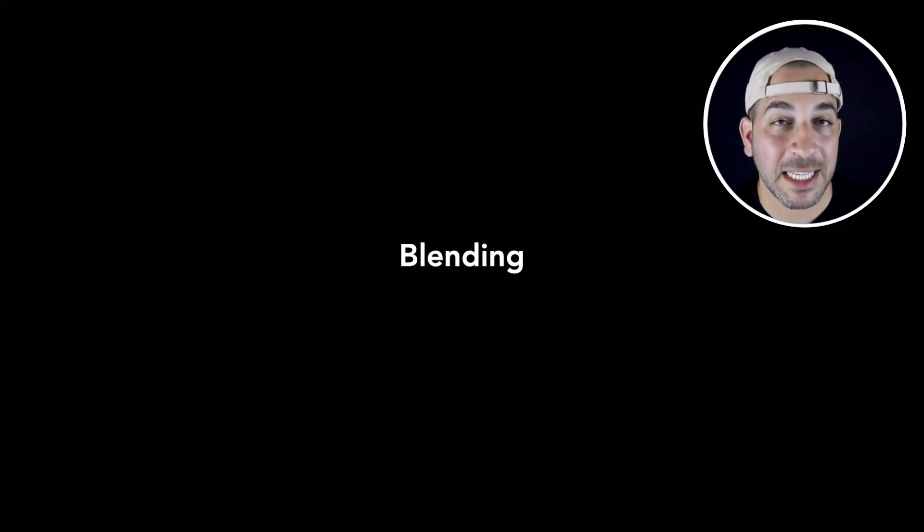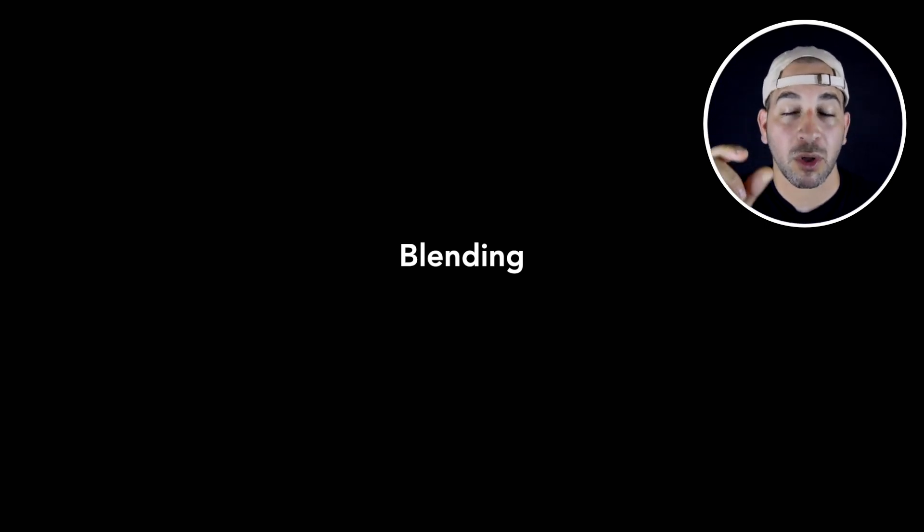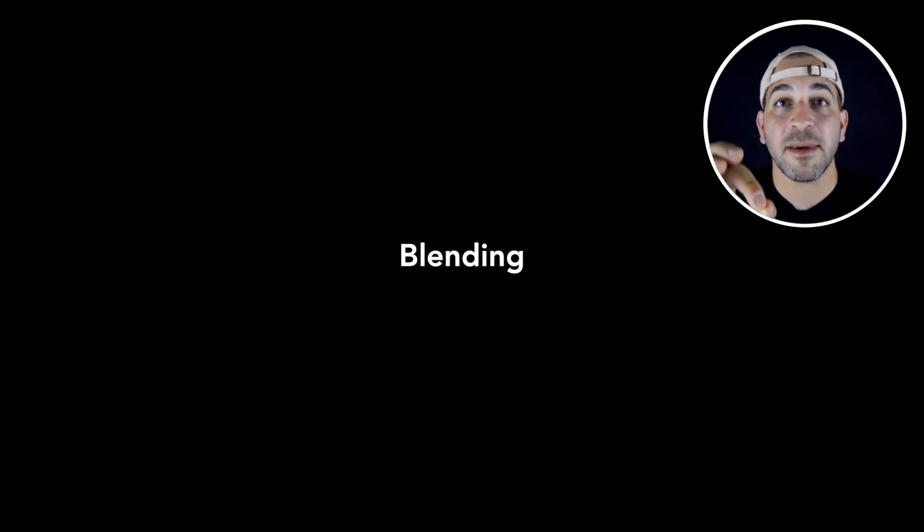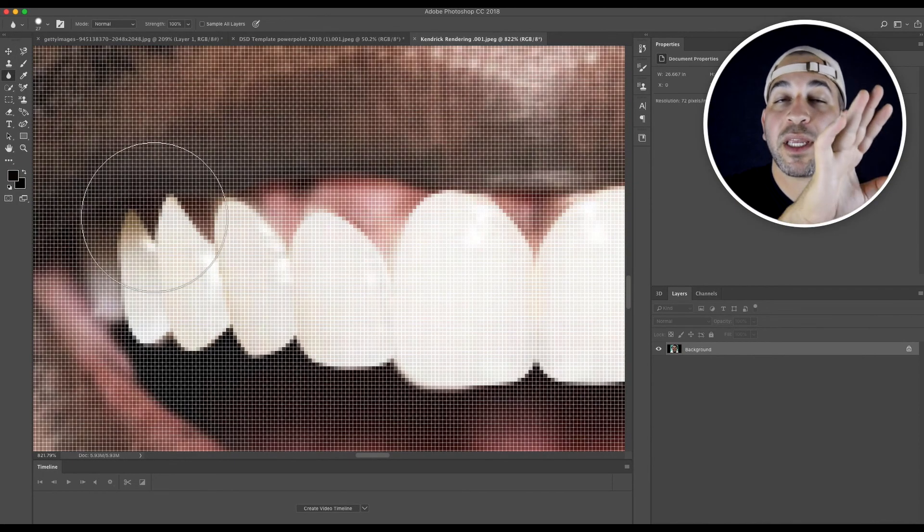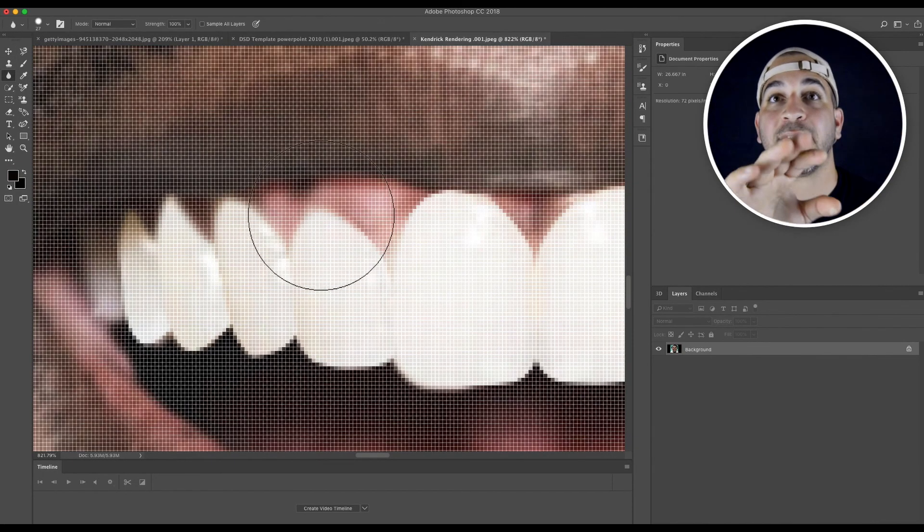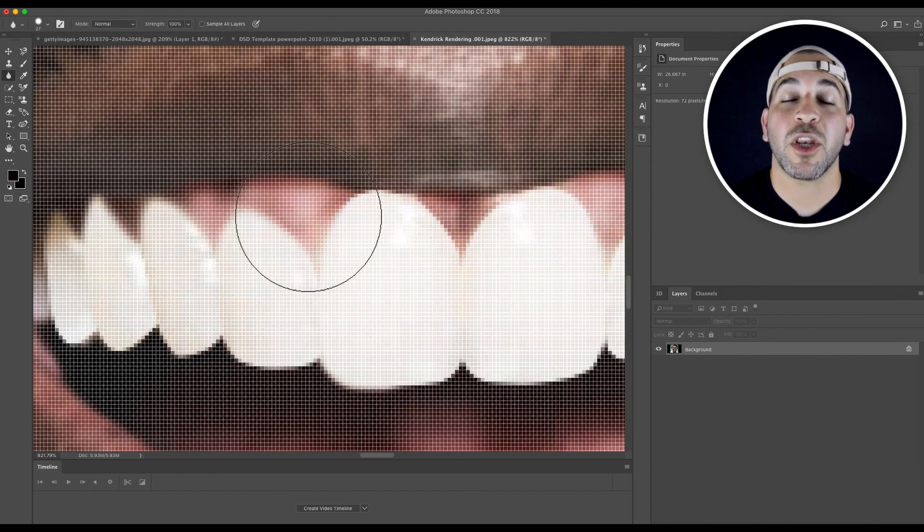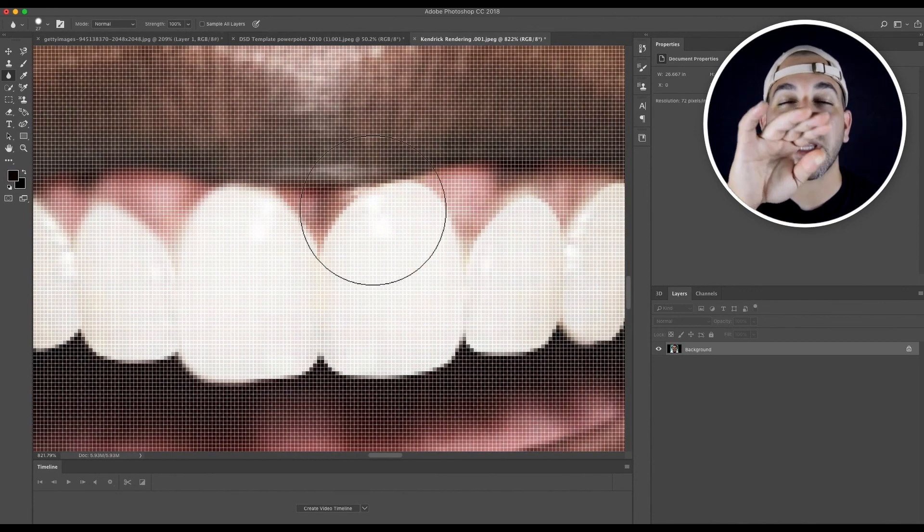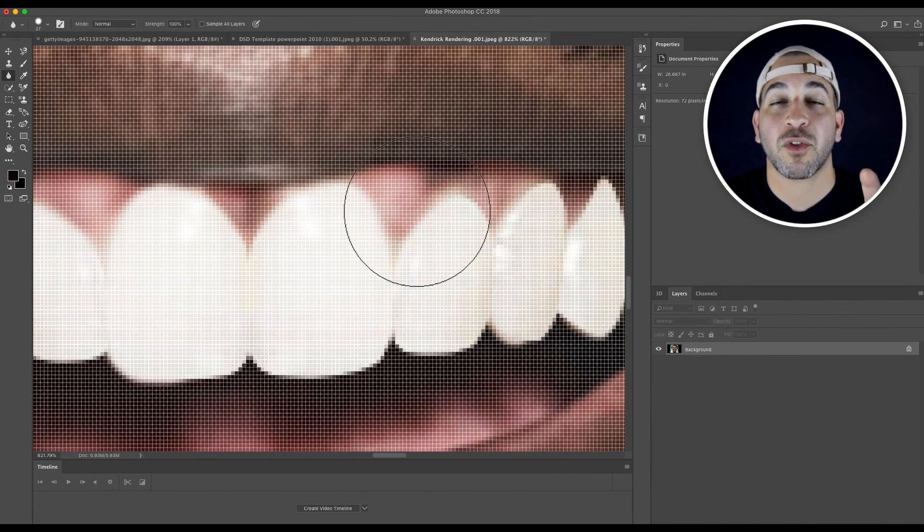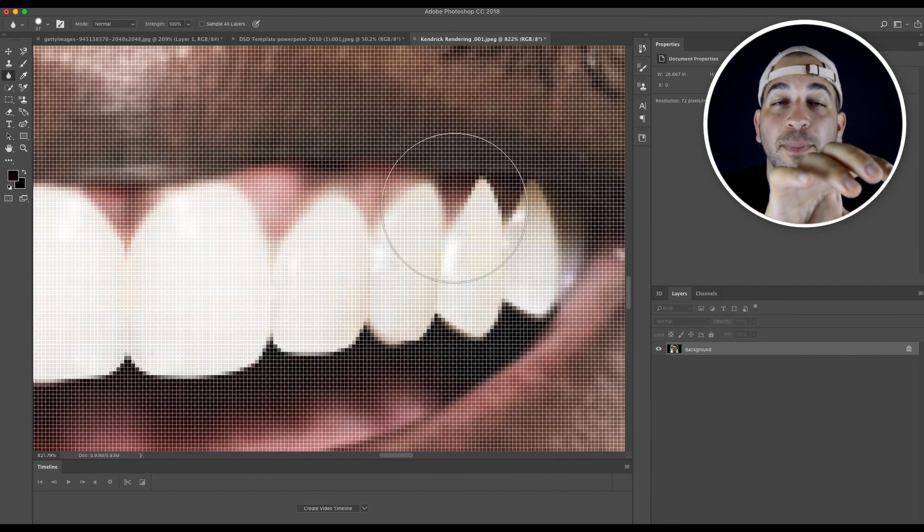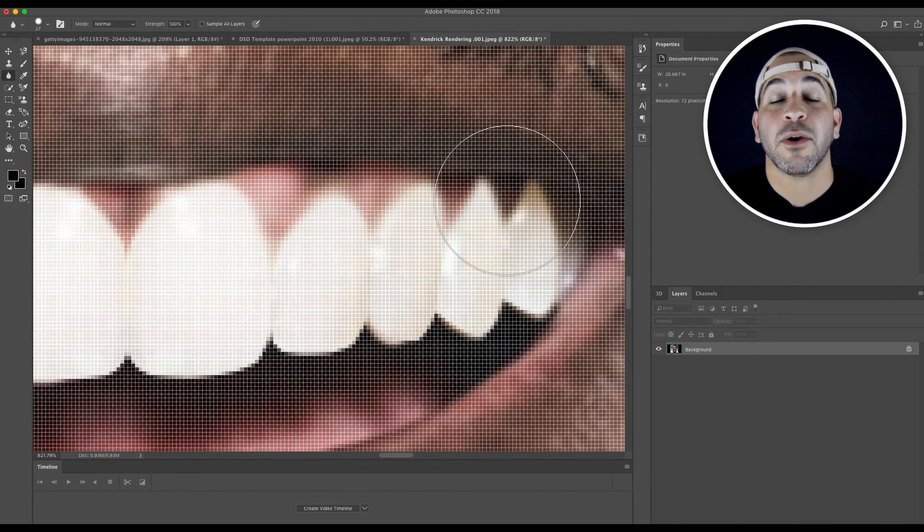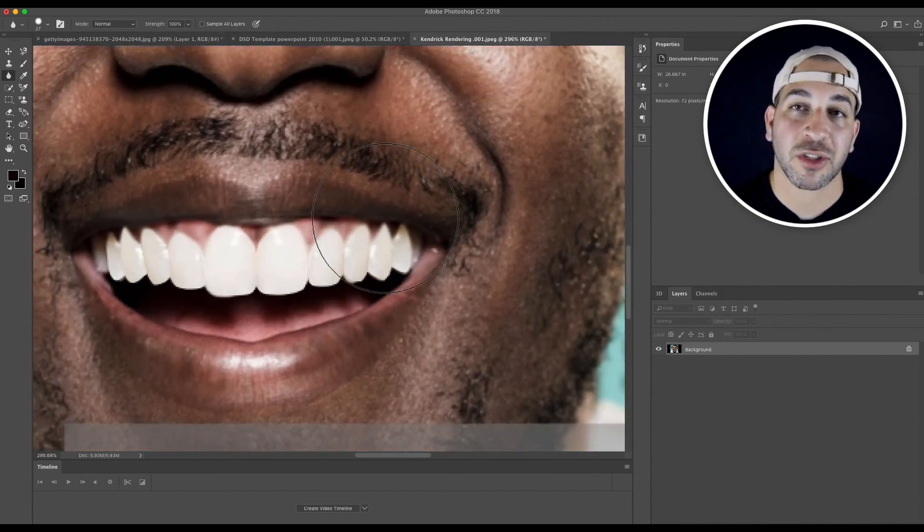And finally, you want to do a little bit of blending. I use Photoshop blur tool, I zoom into the image, and then I blur the transition between the tooth form and the gum line. And when you do this, you don't get that really sharp delineation between that tooth form that you created and the gums of your patient, and it really blends in naturally.